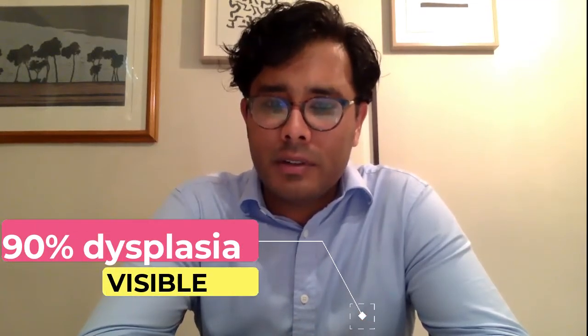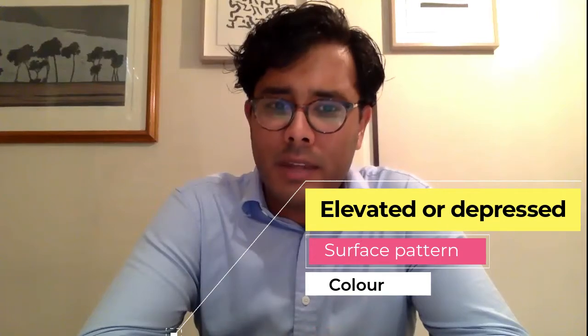but recognising dysplasia can still be difficult. Fundamentally, I look for an area that looks different to the surrounding. Does it appear elevated or depressed, and does it have a different colour? Does the surface pattern appear different?